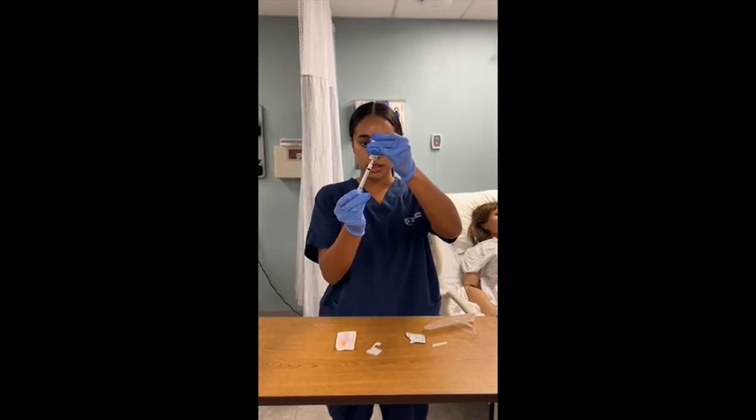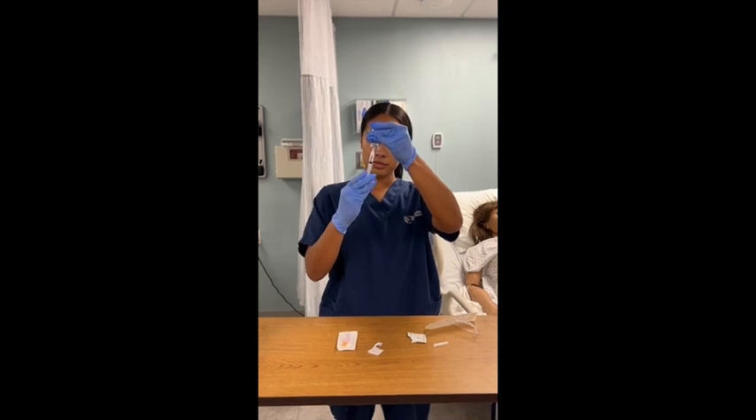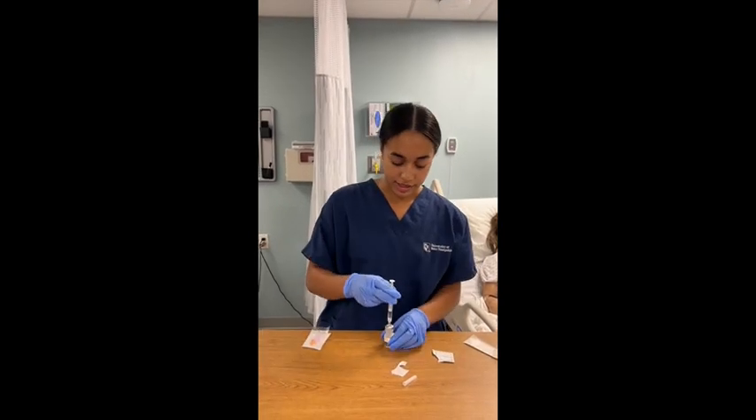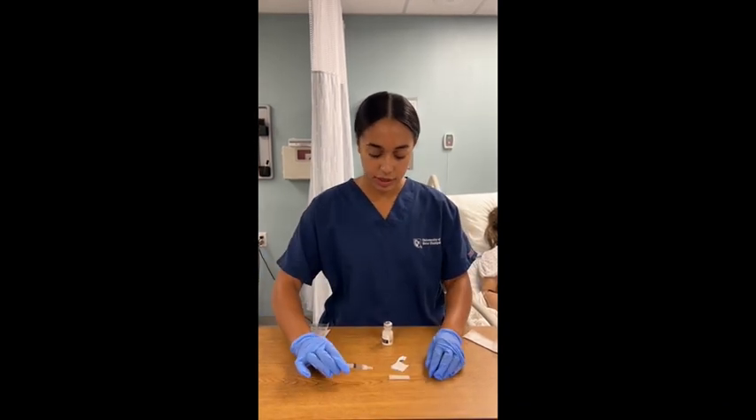Pull back, making sure the blunt is in the fluid. I'm going to put the vial back down on the table, take out my blunt, and then I'm going to recap the blunt.